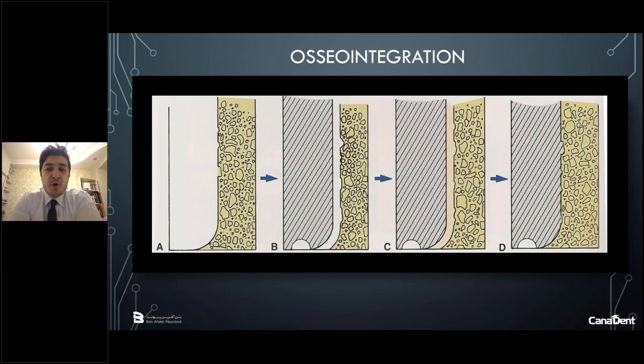The implant site prepared in bone must be below 47 centigrade to prevent cell damage and death in the area. The gap between implant and bone should be much less than 1 millimeter. If the gap between implant and bone is small enough, embryonic bone will rapidly bridge the gap. If the implant is left undisturbed during the healing phase, embryonic bone on the implant surface will mature to lamellar load bearing bone.